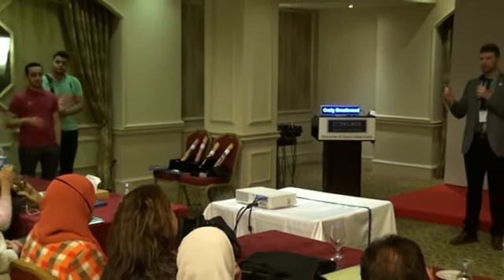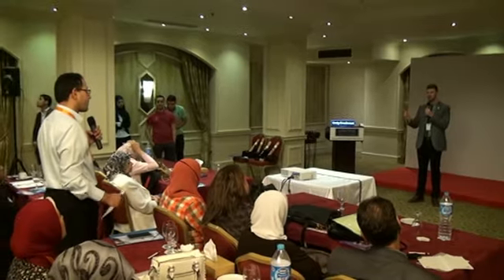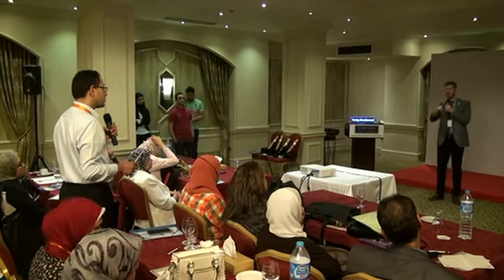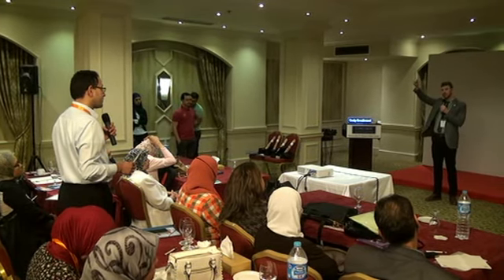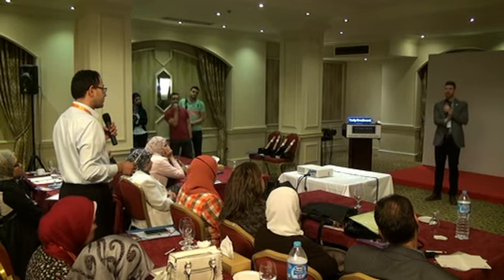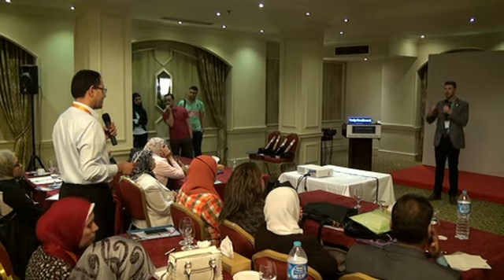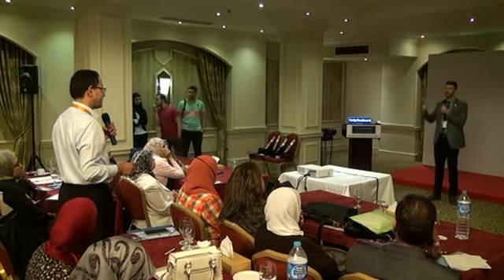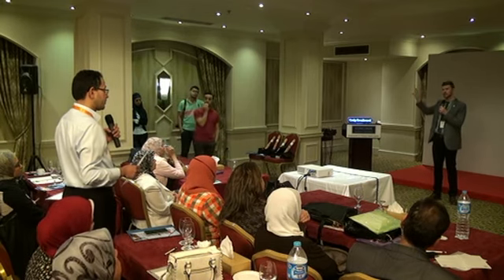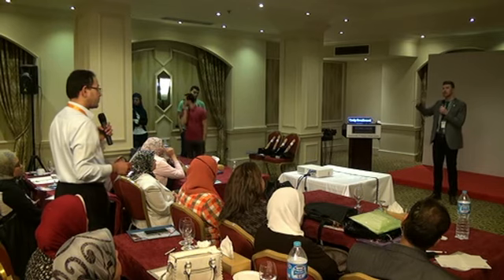And anatomical, yes. So what the researchers have done is give you a couple pieces of information that can be derived from that plot. One is the volume of dead space, and they basically say it's the portion midway through the transition. So whatever volume you are until you get that big sharp rise in CO2 concentration, that volume to the zero, that's your airway's dead space, and after that is your alveolar dead space. That's how they label it. The total dead space, including physiologic, would be using the Bohr equation, the Enghoff modification of the Bohr equation. So that's the PaCO2 minus end-tidal CO2 over PaCO2, and that gives you the fraction.